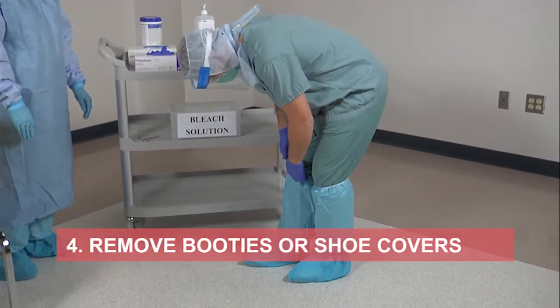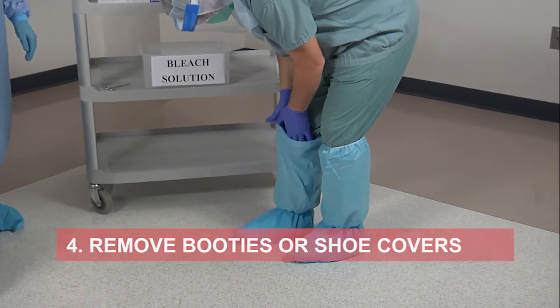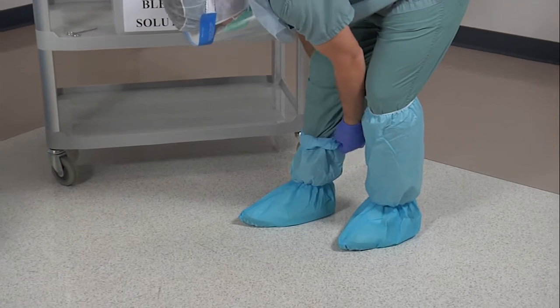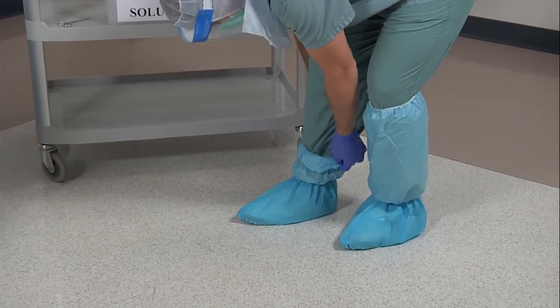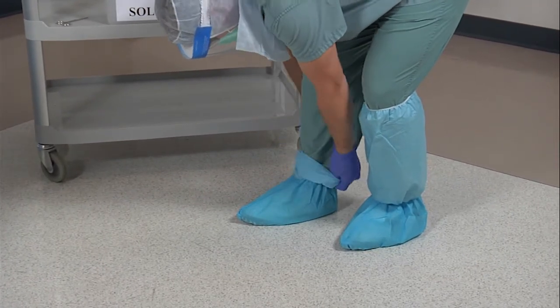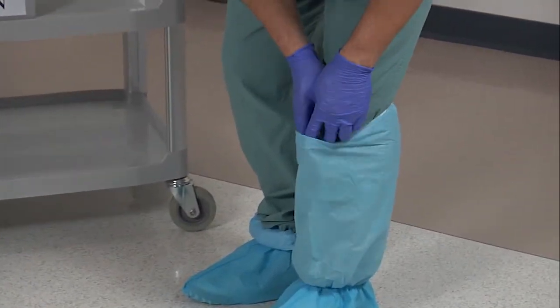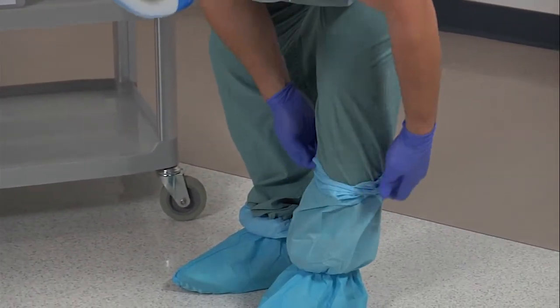Remove your booties by putting your fingers inside the top of the booty and rolling down towards your ankle. Stop. Roll down the booty on the second leg before taking the booties off completely.